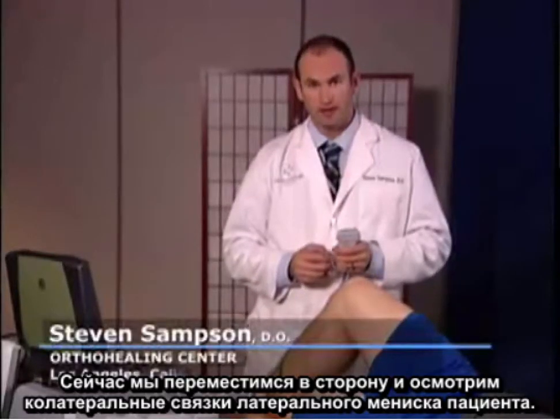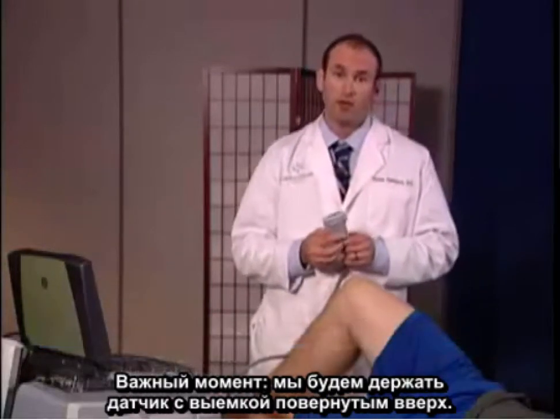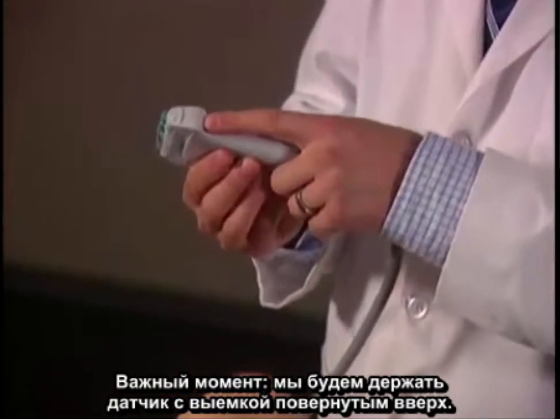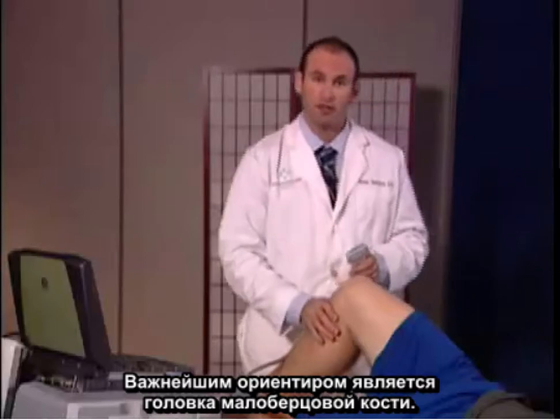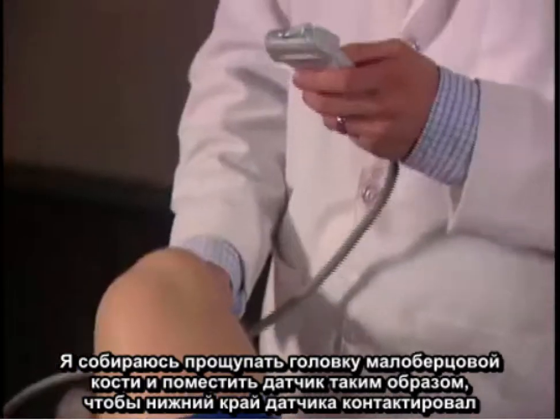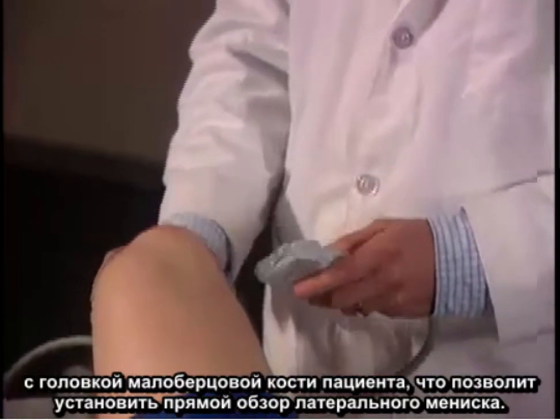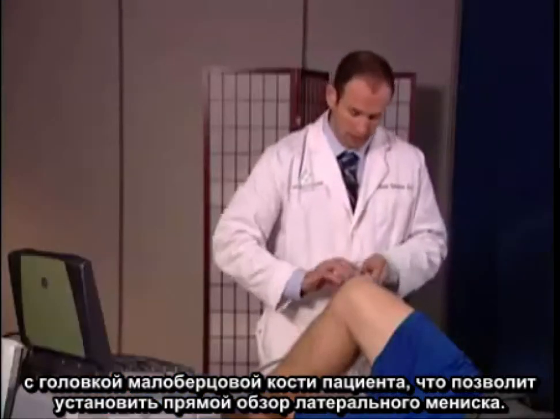Next, we're going to move laterally and examine the patient's lateral meniscus and lateral collateral ligament. We're going to hold the transducer with the notch facing superiorly. An important landmark on the patient is the fibular head. I'm going to palpate the fibular head and place the transducer so that the bottom edge of the transducer is in contact with the patient's fibular head, and that should give us a direct view of the lateral meniscus.